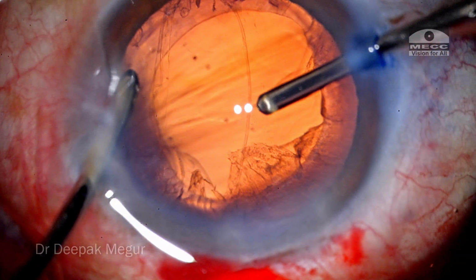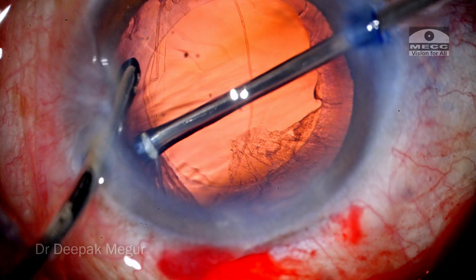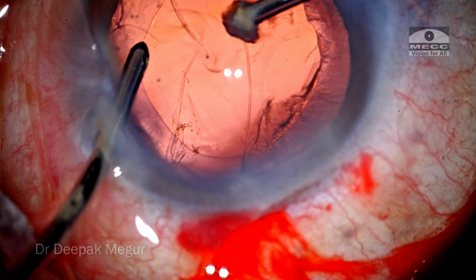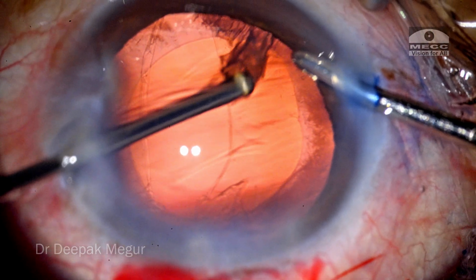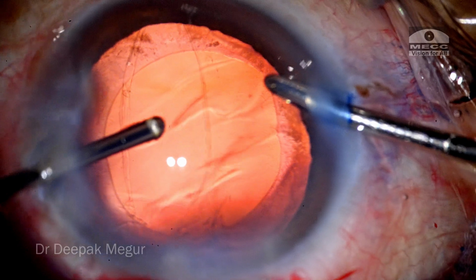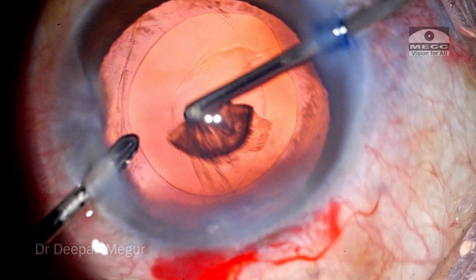Now is the time to deal with the cortex. And using the same vitrectomy cutter, I'm going to engage the cortex, strip it off, and then aspirate it. The hands are switched and the cortex from the other quadrant is then similarly aspirated with the vitrector. The tiny bit of cortex under the subincisional area is also taken care of by the vitrector.